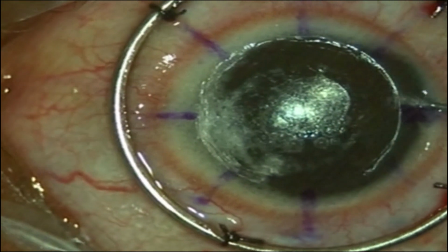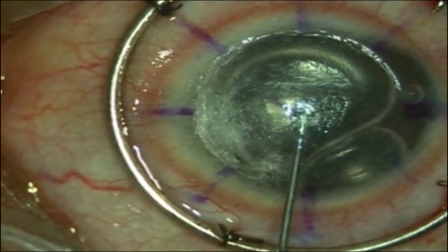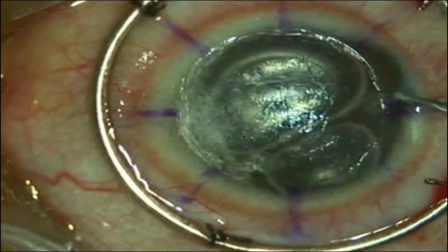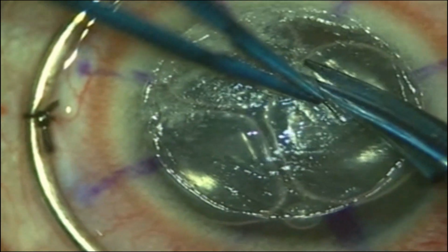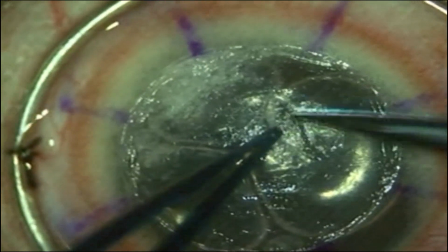A blunt cannula with viscoelastic was introduced into the space as an attempt to separate the Descemet's membrane from the posterior stroma. However, this resulted in the viscoelastic entering into the anterior chamber. So a manual dissection of the stromal layers was gently carried out.